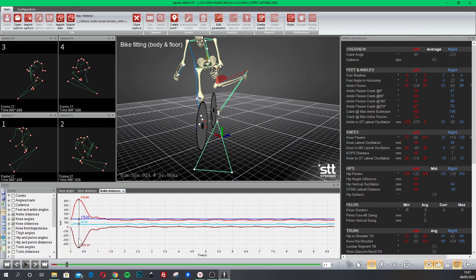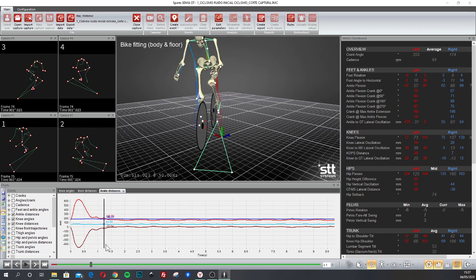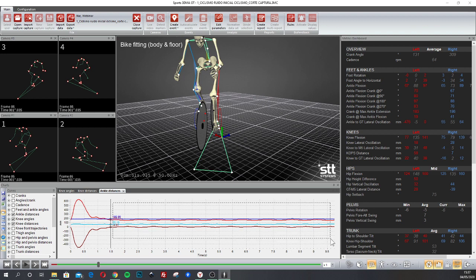We can directly select a region of interest, for example, from second 1.5 until the end, or we can trim this part and generate a copy of this capture, but only with the totally clean information. Okay, so let's go both ways to do that.